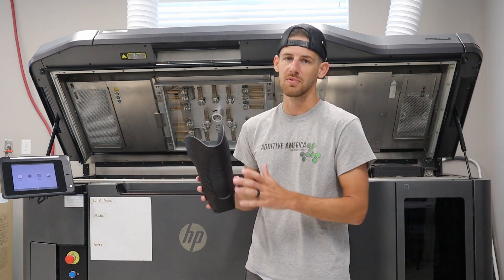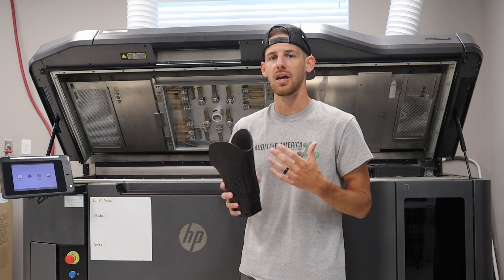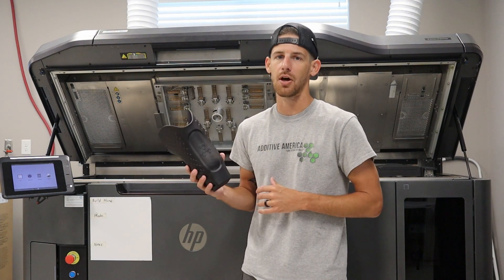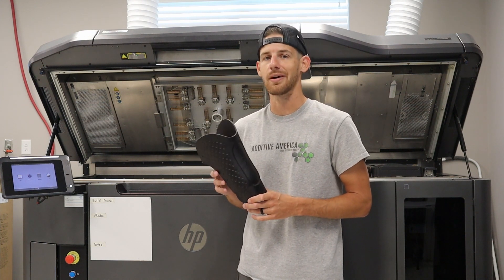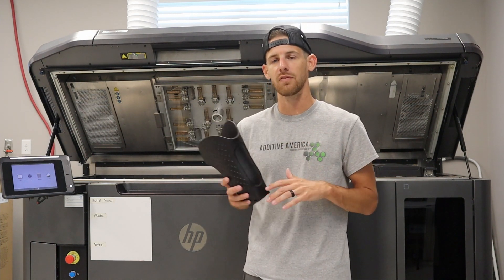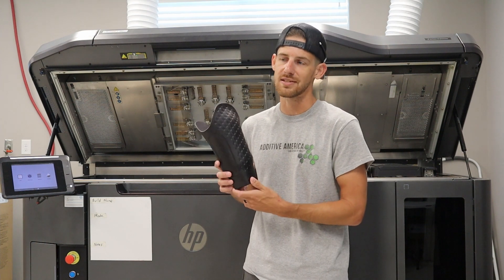The way we achieve this shape is we work with practitioners and folks all around the country. Basically we get scan data from them, or they send us a cast, things like that, and then we're able to scan and create the geometry on the computer. We build this model on top of that geometry in a program called Geomagic Freeform Plus. We've already done the casting, the check socket, the diagnostic socket, everything has gone well through the test fittings, and now we're at this point creating the definitive prosthesis.